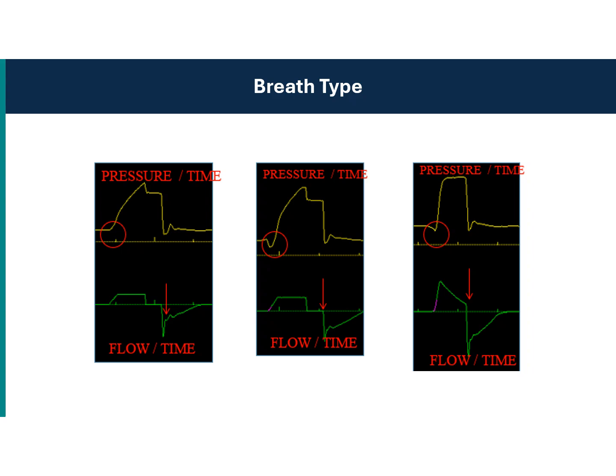And here also you can see, but here you can see that the inspiratory flow is not reaching zero before it switches to expiratory, because we have set the ventilator at 25% of the peak flow. So this is the peak inspiratory flow, and when the flow drops to 25% of it, it will switch to the expiratory cycle of the respiration. So this is the pressure support ventilation, and this is the assist control ventilation with volume control, and this is again volume control.